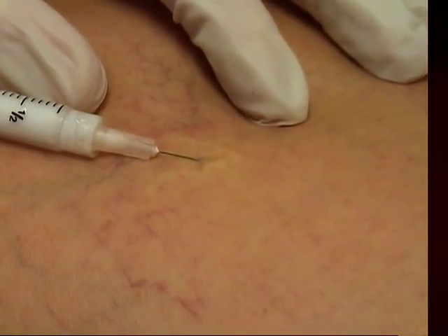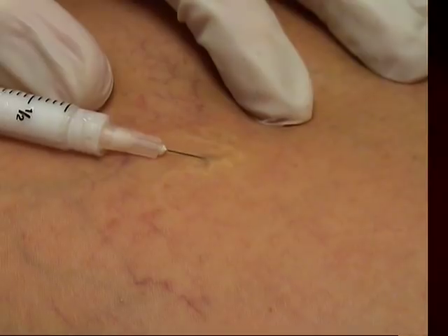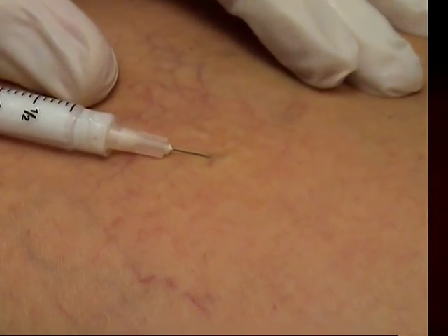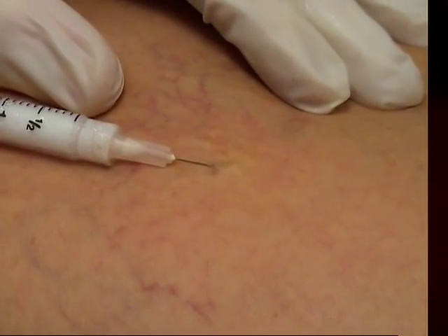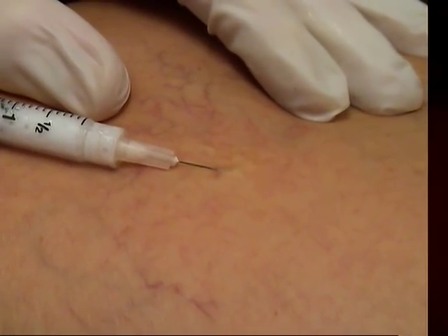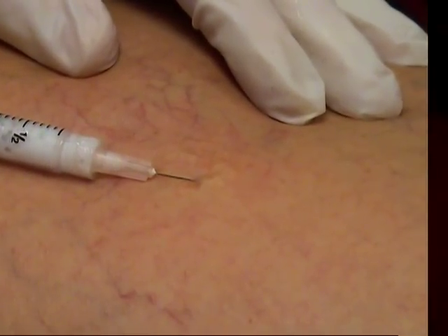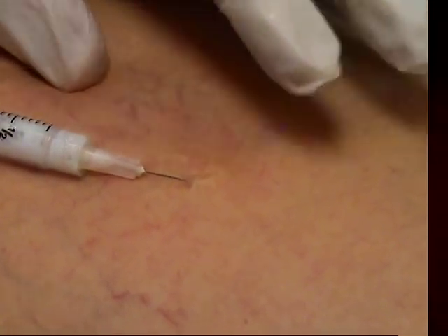Gentle pressure here. This is foam — Sotradecol 0.1%, 0.1%. Now this goes in more slowly and does not reach quite as far as the regular sclerosing agent, but it hangs around for a long time.